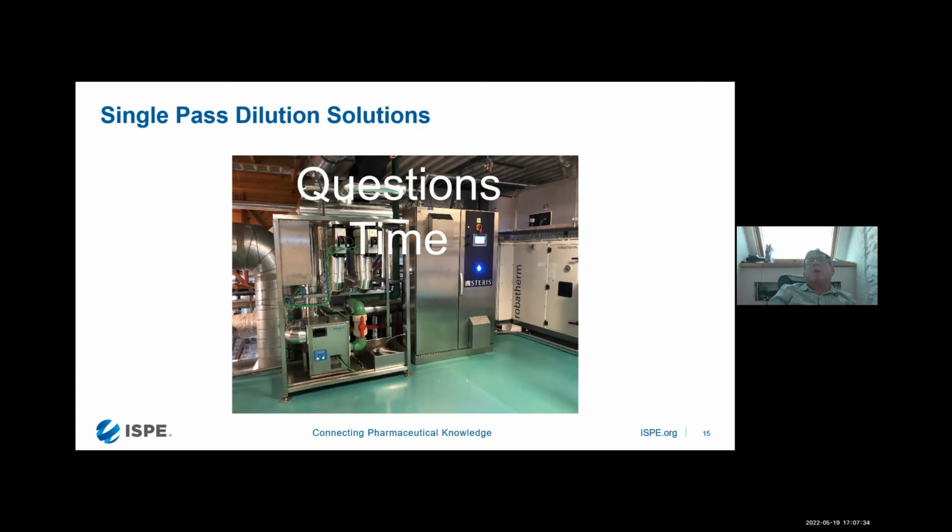The second no is that so long as there is airflow through the HEPA filter, the airflow will carry the H2O2 out. If it were liquid, that would be a different story. If it's liquid, then it can change the differential pressure of the HEPA filter and even damage the HEPA filter. But so long as this is kept in dry form, there is no problem for the HEPA filters. So long as that's kept, we will have no issue with it.